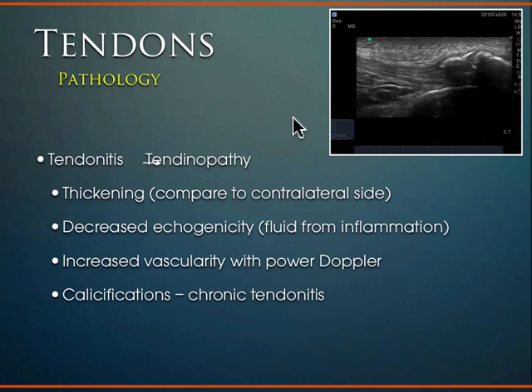And then in general, you can see other changes, like we hear about calcific tendinitis. We typically hear about that in the shoulder, the rotator cuff muscles. And just like bone, the calcific changes that you can see on this image here tend to be very thick, hyperechoic structures. So these are calcific changes within the tendon architecture through here. And just like bone, you're going to get a lot of deep shadowing below that very hyperechoic thick tissue because the sound waves don't penetrate through.